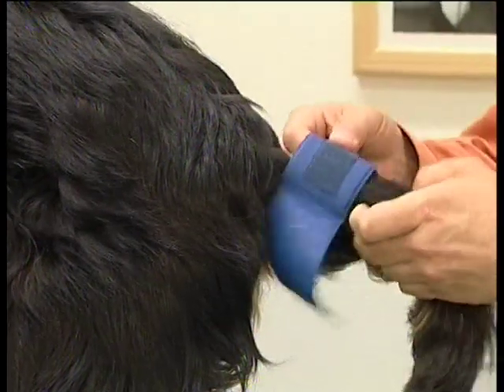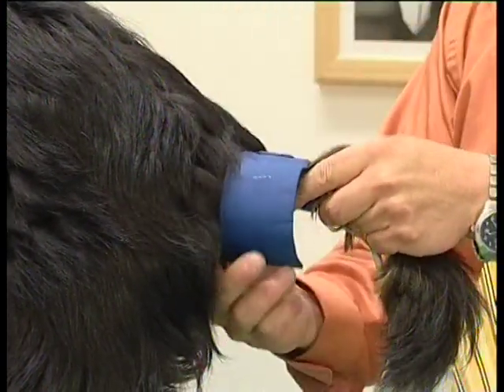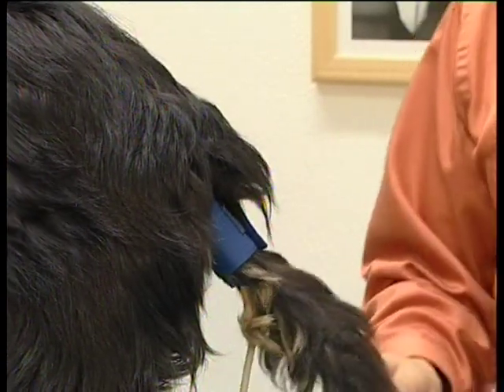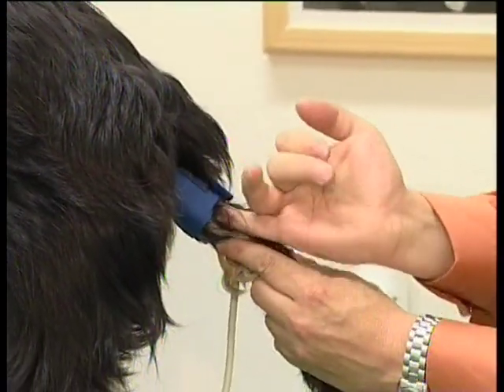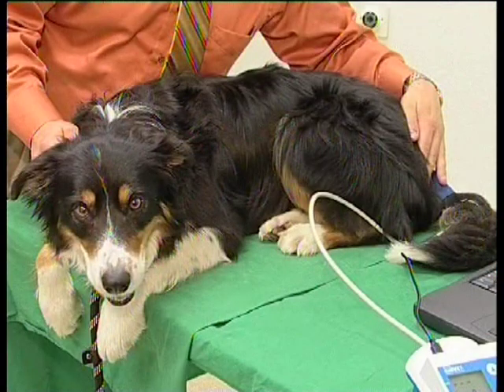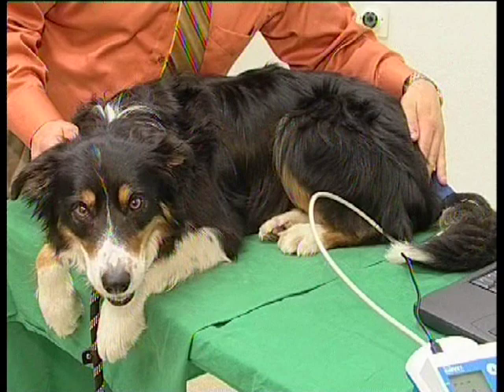Especially very excited or shivering dogs, but also dogs with some aggressive potential, may be preferably measured at the base of the tail. The cuff is placed appropriately when the small finger just fits beneath the cuff. Dogs, especially larger ones, seem to like the down position, and it could be a preferred position for the measurement.